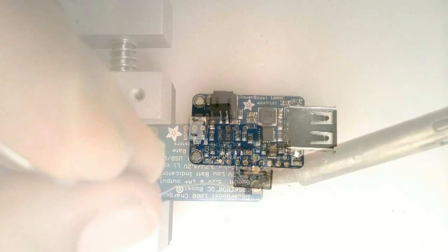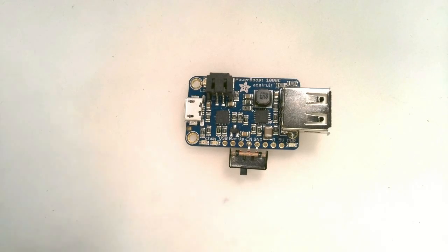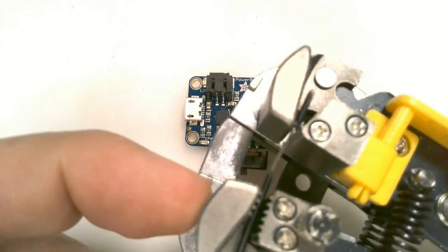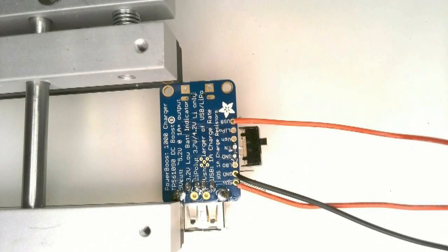Next, prepare 3 wires to connect to the board. 2 red ones for power and a black one for ground. In the tutorial illustrations, we used green for ground, but technically it should be black. The wire should be about 4 inches long. Strip both ends of each wire. Insert them into the underneath side of the board.